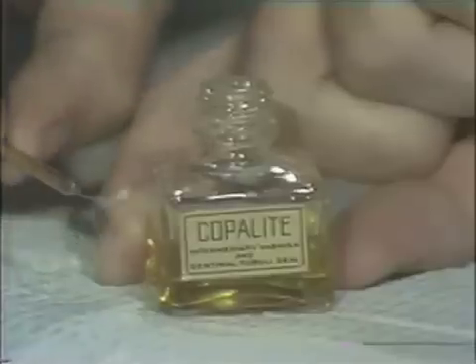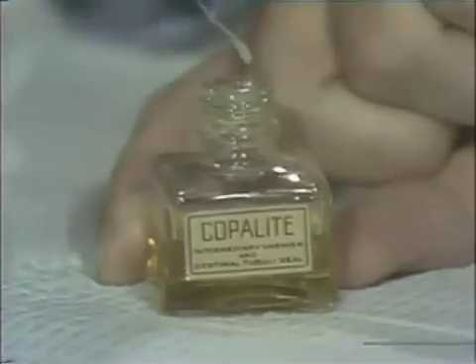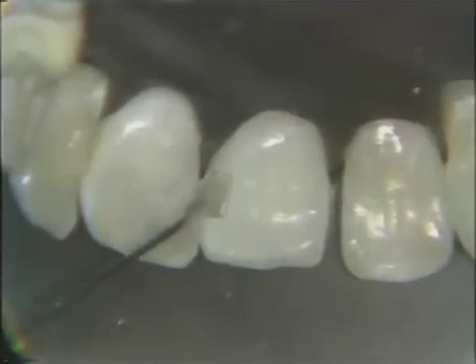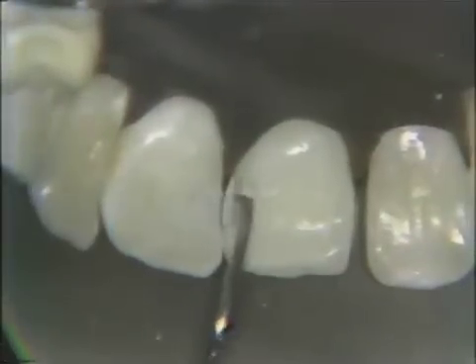Now, we have to be extremely careful that no Copalite comes in contact with the cavosurface margins, or any of the enamel, really, in this preparation. But this is covered over the Cavitec and any dentin that still might be exposed, keeping it from the enamel walls. We're mixing zinc phosphate cement, primary and secondary.